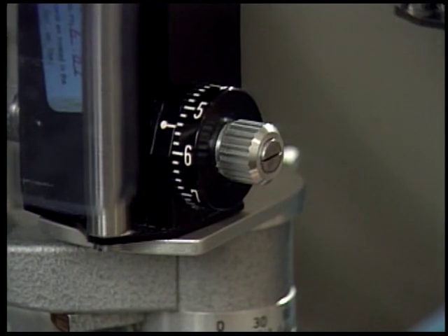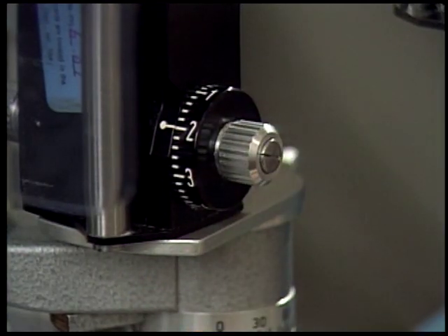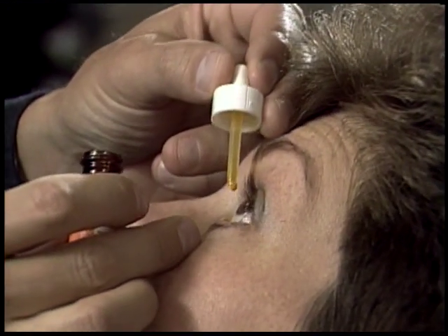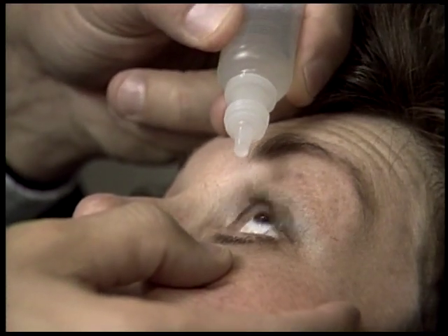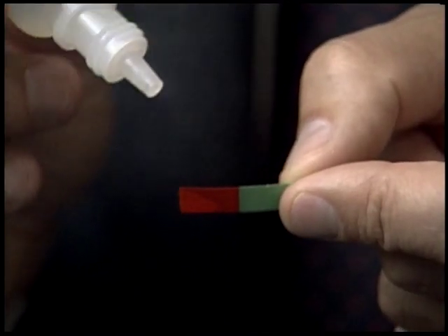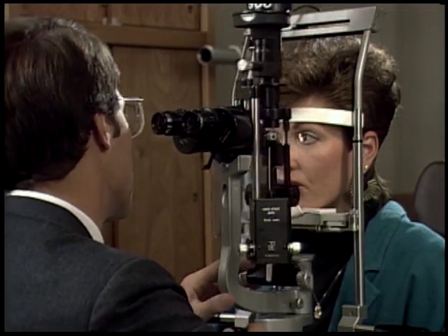With many patients, it helps to preset the tonometer at 20 millimeters of mercury so that less adjustment will be necessary for the specific measurement. Prior to testing intraocular pressure, a topical anesthetic and fluorescein solution, such as Fluoresce, is applied to each eye, and the excess is wiped away. One may also apply fluorescein after administering a topical anesthetic by touching a moistened fluorescein-impregnated strip to the inferior conjunctival cul-de-sac. In order to avoid confusion, check the right eye first, then the left eye.